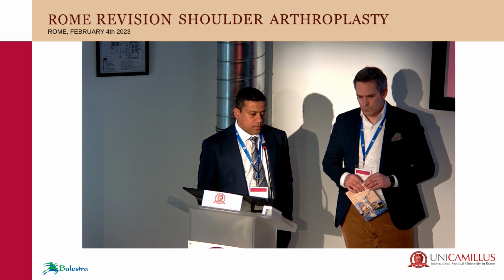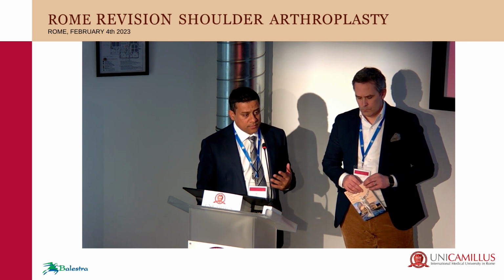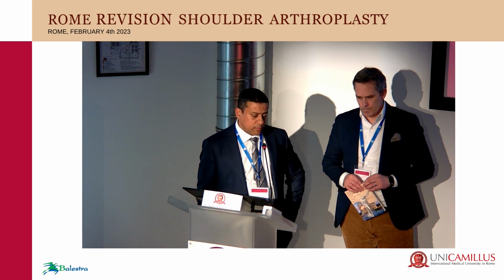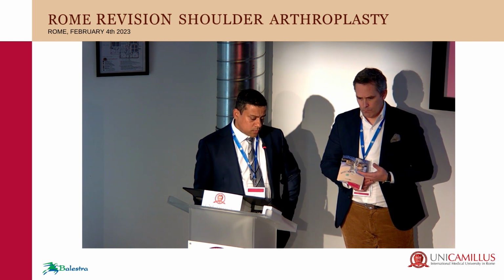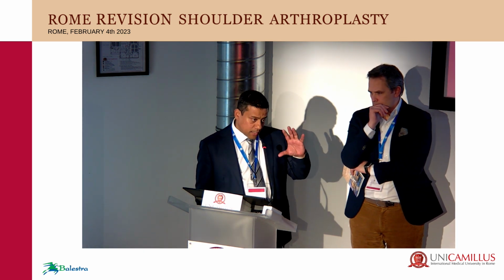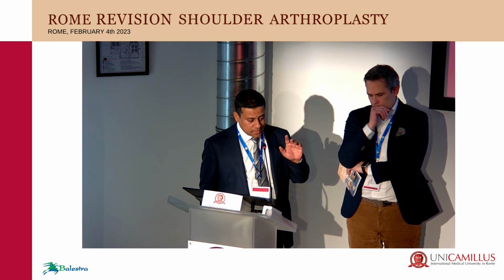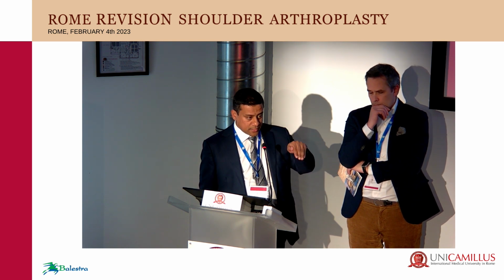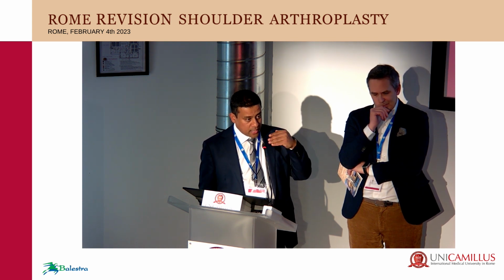And this was the question where, the humerus, you can pull stuff out, but in the glenoid, if the peg is really well fixed, especially in like a Delta Xtend or something, then I asked Luc that, if I remove this, I'm going to destroy the glenoid and we'll have a bigger problem. And Luc and Ludwig's philosophy is that if the peg is really well incorporated, and there isn't anything behind the base plate, then it's not infected all the way down there. So what I do is, as I said, I'll take all the screws out, and I use a 90-degree saw, which we use for the latarjet to cut the latarjet. I use that and I run that around the base plate, behind the base plate.